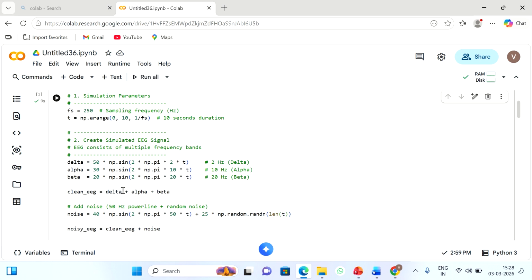If the length of the noise is less than or greater than the EEG signal, then the processing will not work. Suppose you take one cycle of EEG, and the noise is shorter: 100 samples will be applied on the EEG signal, but the noise samples will be reduced, so that the conversion from analog to digital and the filtering process will become erratic.